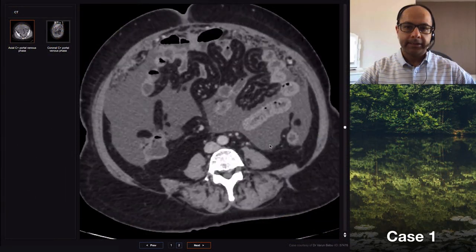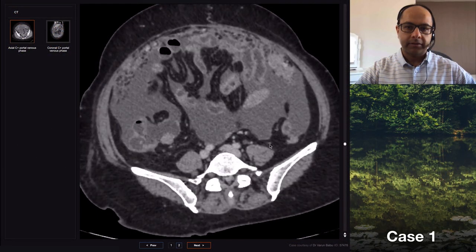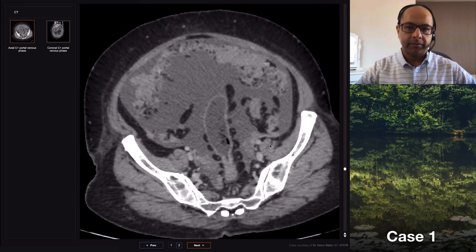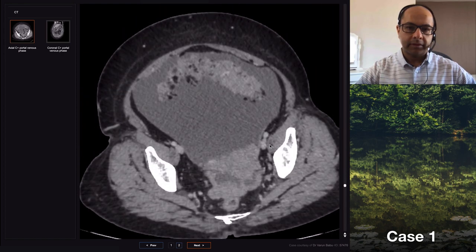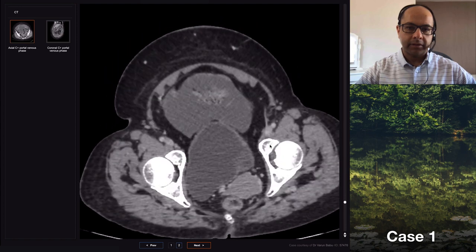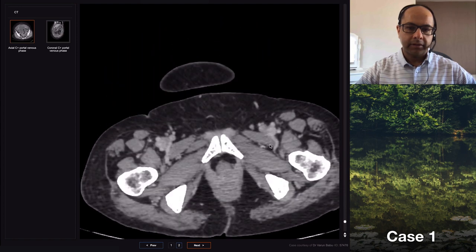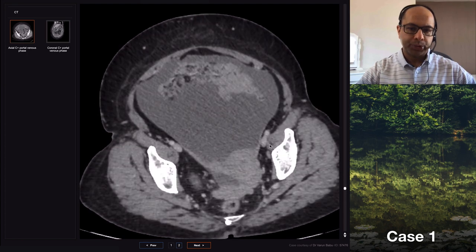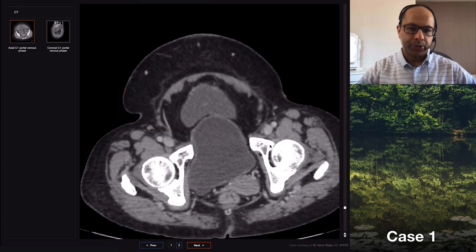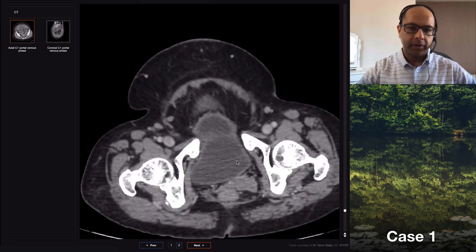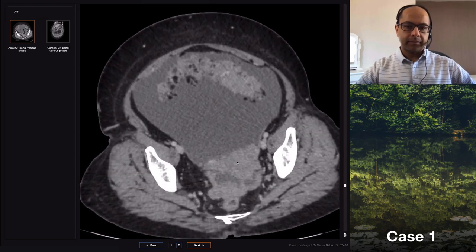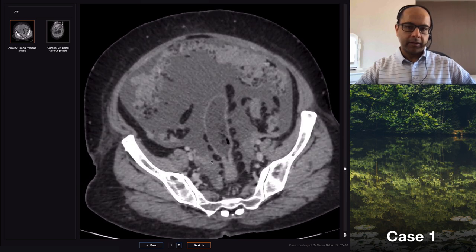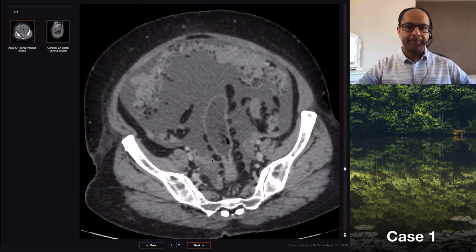There's gross ascites, omental thickening, and I can see that there are omental cakes in the left iliac fossa and also in the right flank. In the pelvis, the right adnexa is slightly bulky.